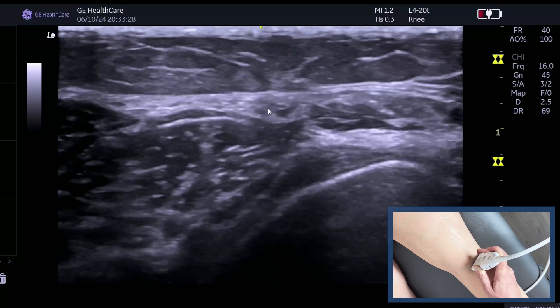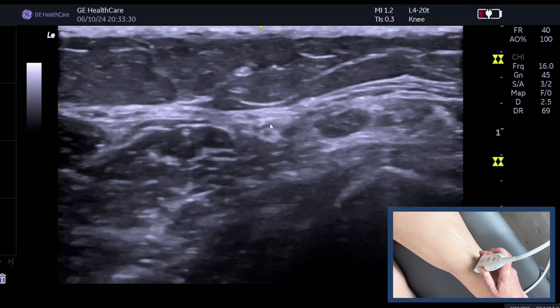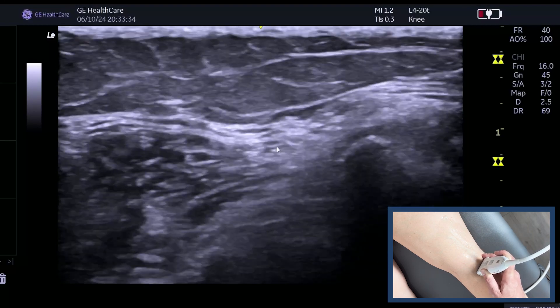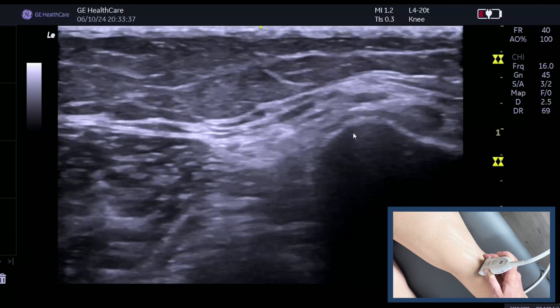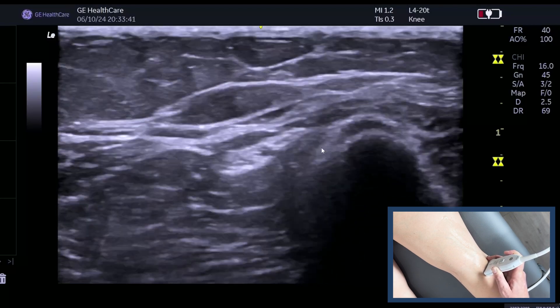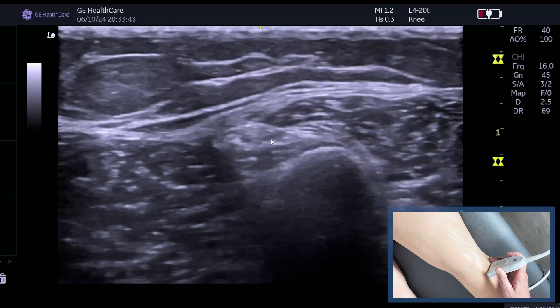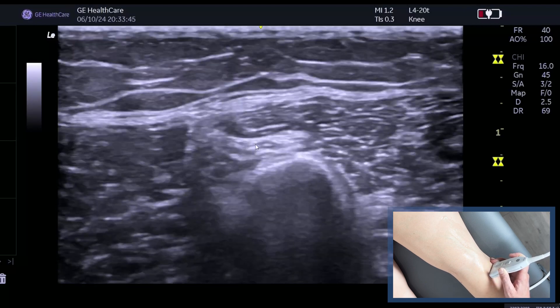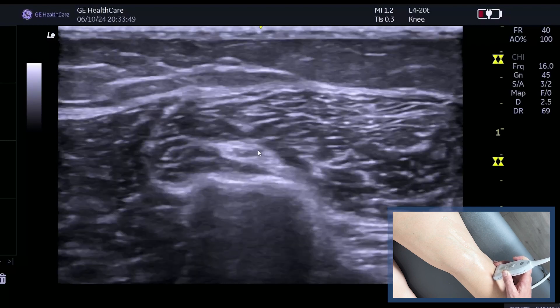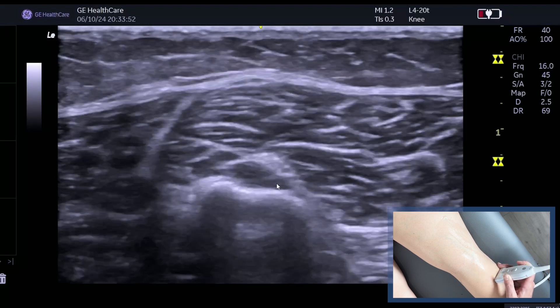So we keep tilting — you can see the fascicles — and then the next place where it's particularly vulnerable is where it goes over the fibula head, which it's about to do now. There it is, posterior to the fibula head; this is the fibula head coming up, and as we travel more distally you see it going over the top of the fibula. Particularly here — particularly in football — if you get kicked, that's where you can start to get some trauma, and then it dives deeper.